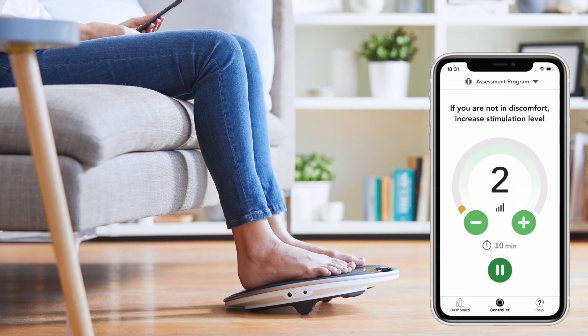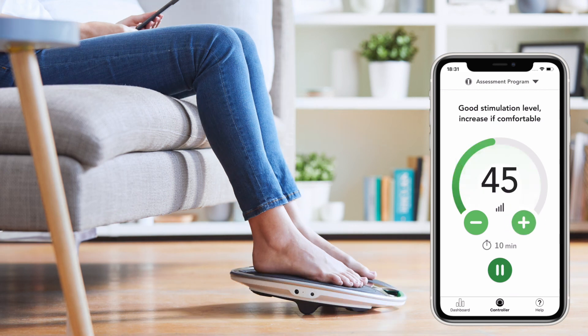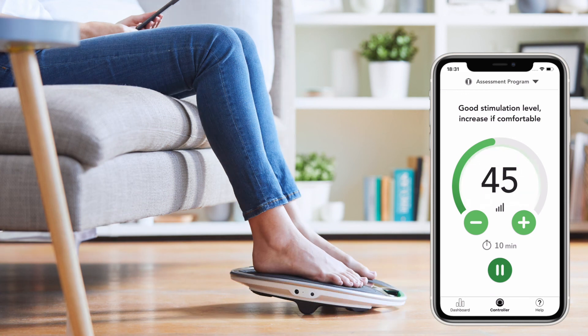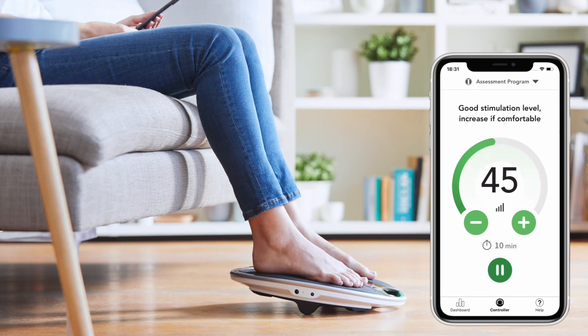Continue to increase the intensity button until you feel a very strong leg muscle contraction and the device starts to rock. The maximum intensity is 99 and most people use their Revitiv on at least 40. The smart intensity finder helps guide you to the right intensity level. Sensors in your device detect when you start rocking, which is a good indication that you have achieved a good level of leg muscle stimulation. With the rocking, the intensity arc will change from orange to green. Your goal is to always have the arc display green during each session.